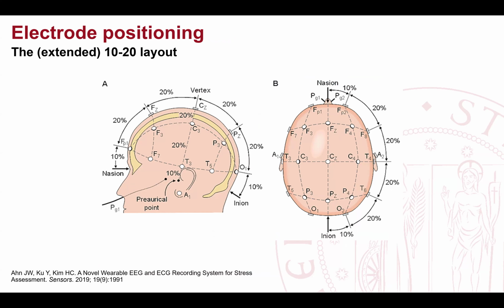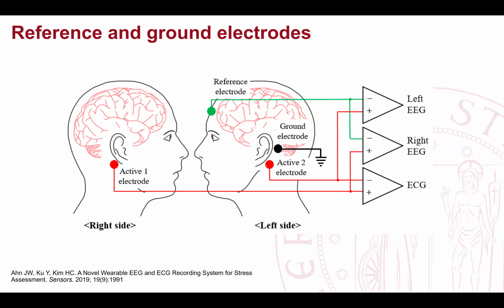Yeah, because you said that we usually measure the value of an electrode in accord with another one that we use as a reference. Okay, I understand with the ground. But here it's not with respect to the ground. The ground is used for the collection. It's not our zero level. So we have the ground that collects the current once it flows, then it goes to the ground and is removed from the system.